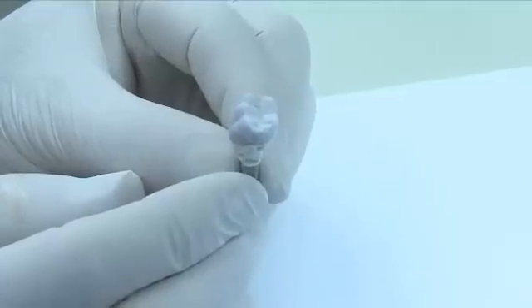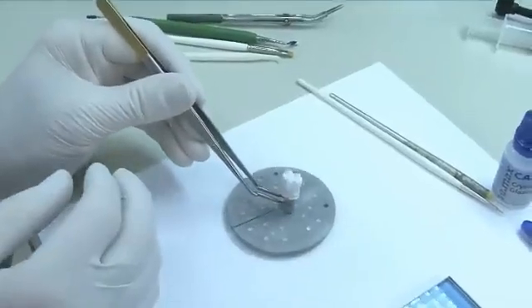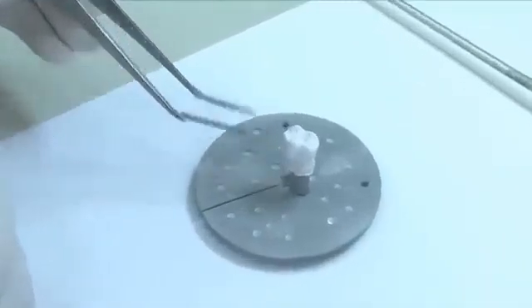If there is blue show-through in the uncharacterized areas of your restoration, additional glaze spray may need to be applied. Place the restoration in the silicon nitride firing tray in preparation for firing.